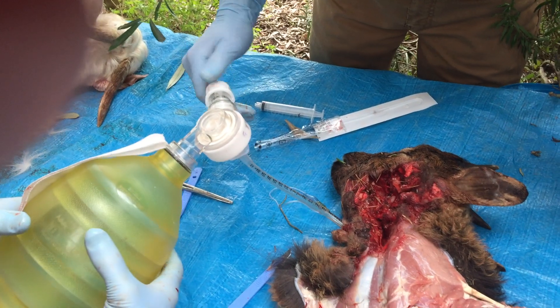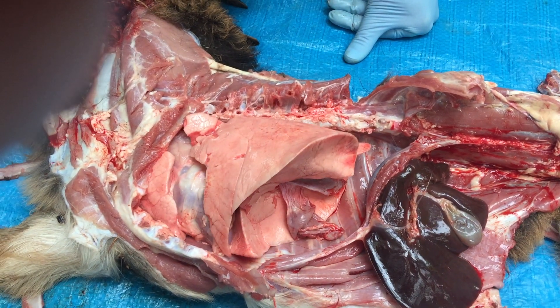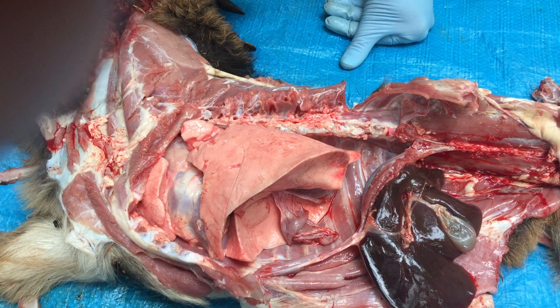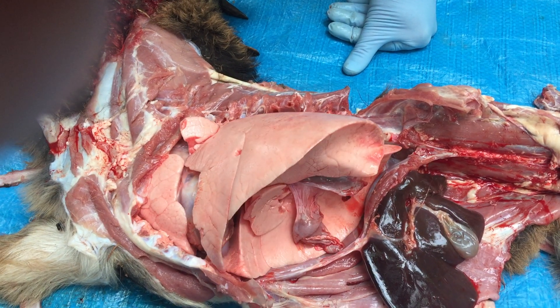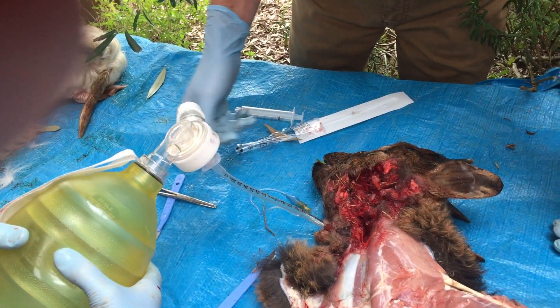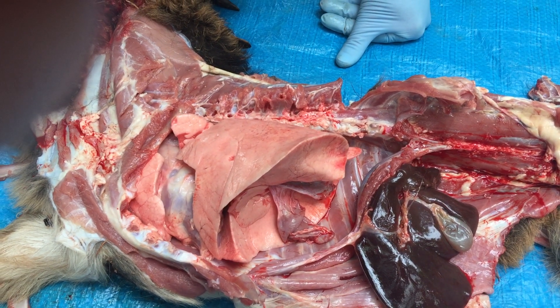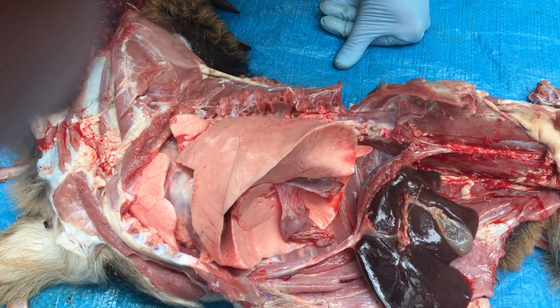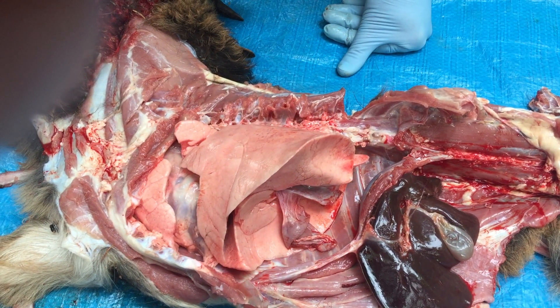And take that up to ten — that's ten of PEEP — and up to fifteen. We can see all of that splinting of the alveoli, and that's why we use the expiratory pressure.